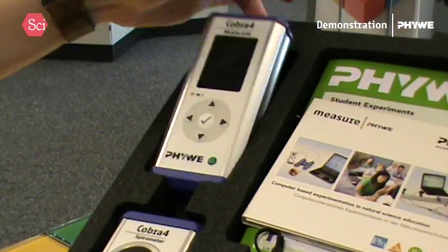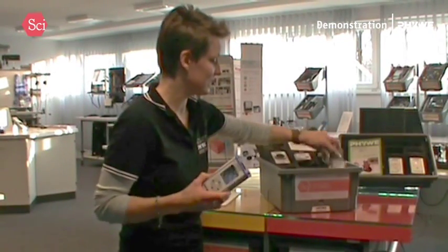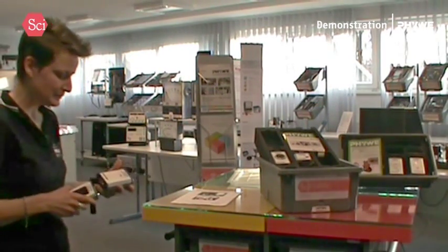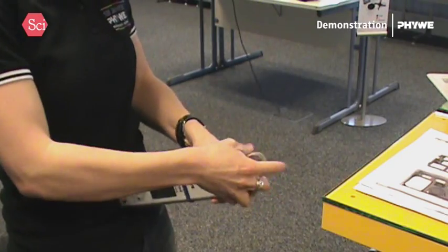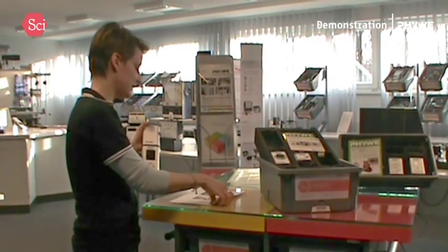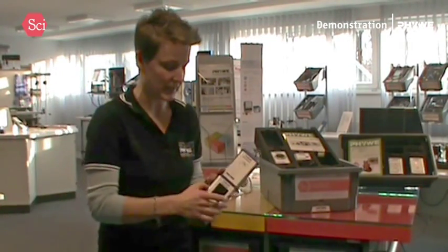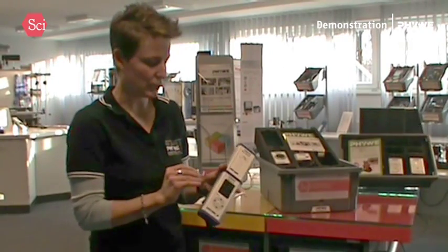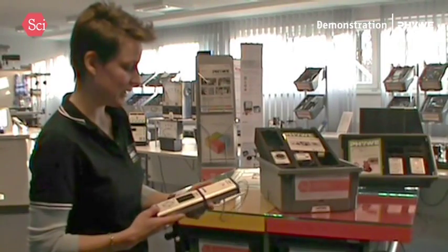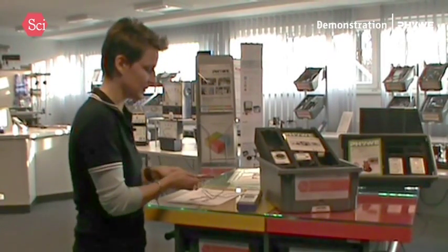What I'll do today is explain to you how it works — how the Cobra 4 mobile link here is working in combination with the skin resistance sensor. Cobra 4, as you know, is our measuring system, a complete family with different basic devices. And we here have the mobile link, which can be read directly on the display or with data recording on an SD card to be read later on the computer.